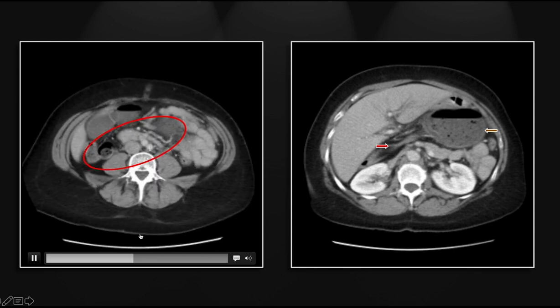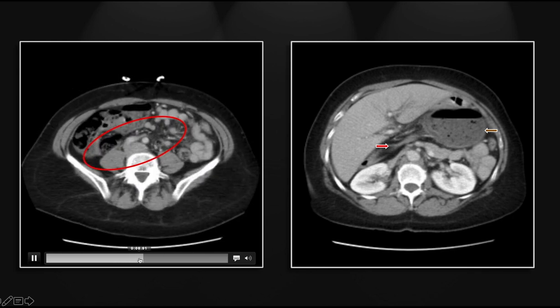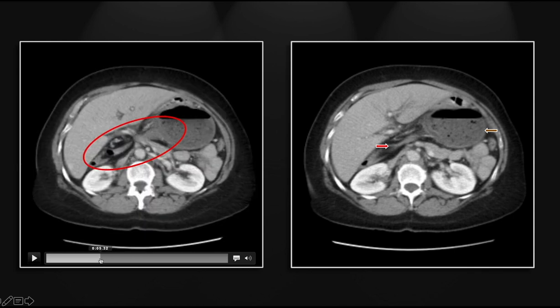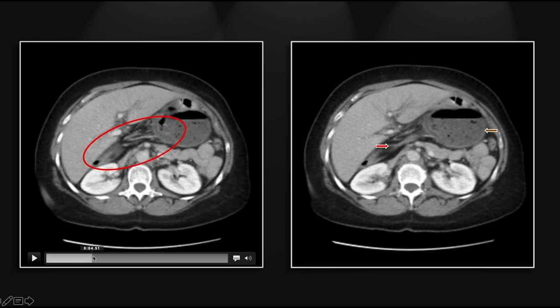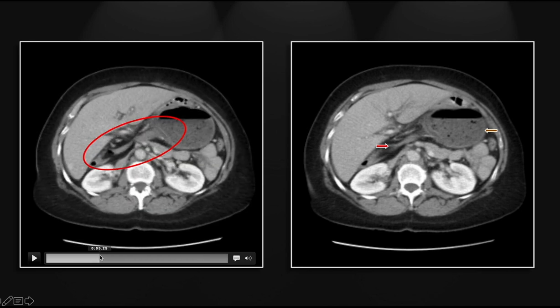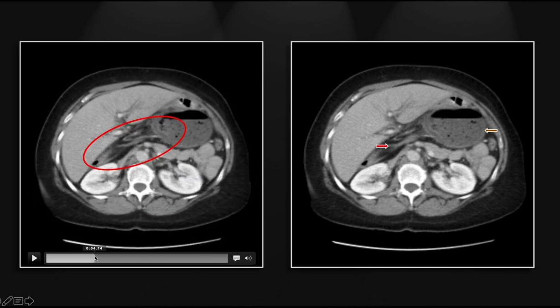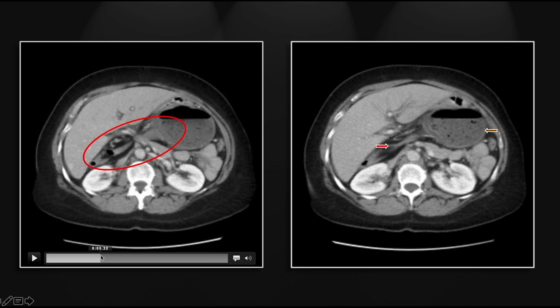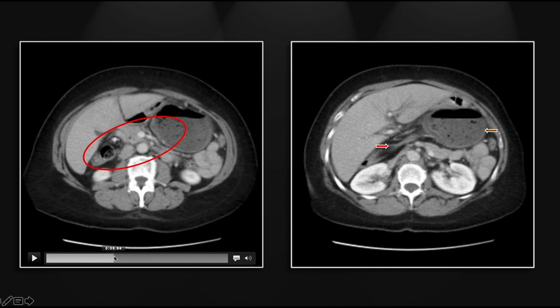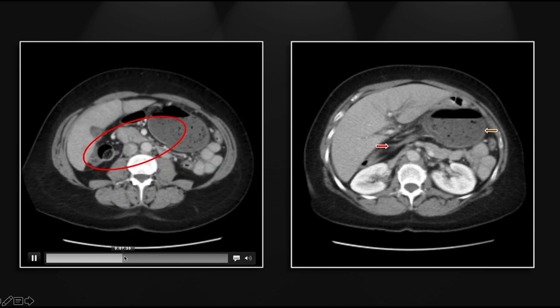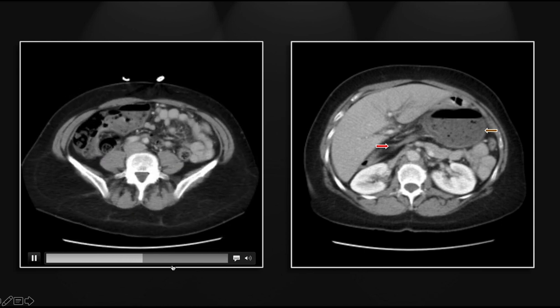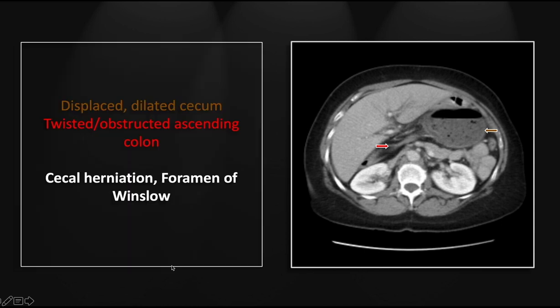You can see this is ascending colon on this side, and the cecum is to the left, with that intervening stretched, elongated, and almost occluded segment. So that is a cecal herniation through the foramen of Winslow.